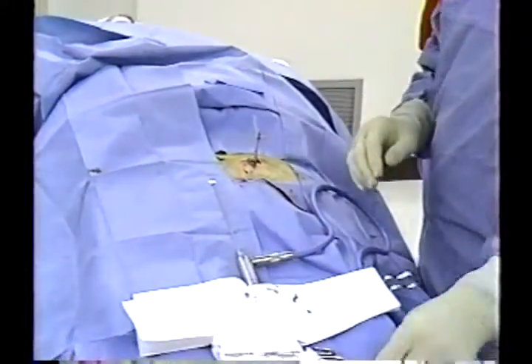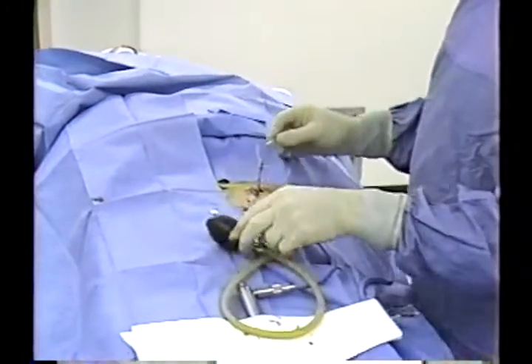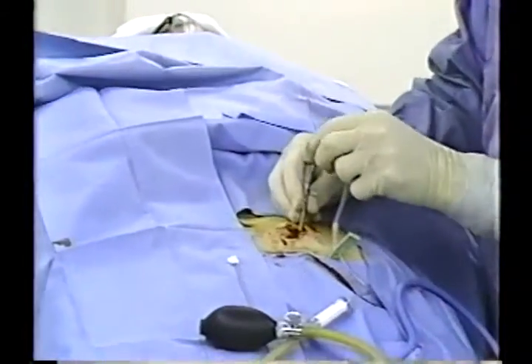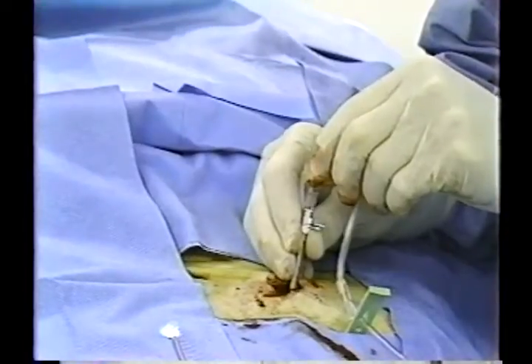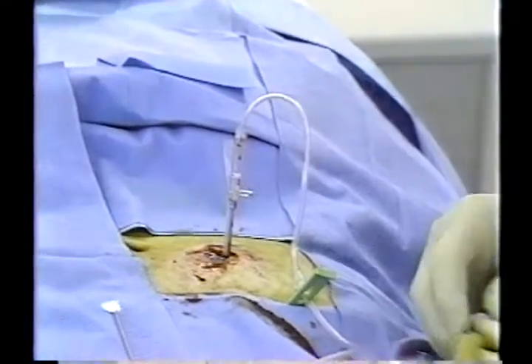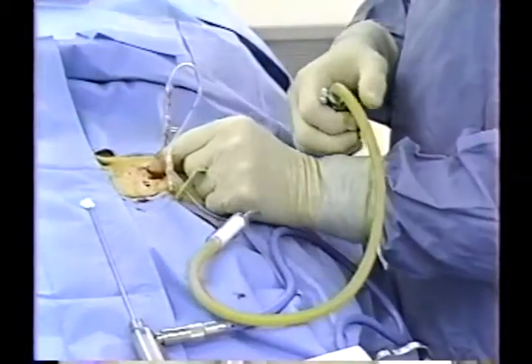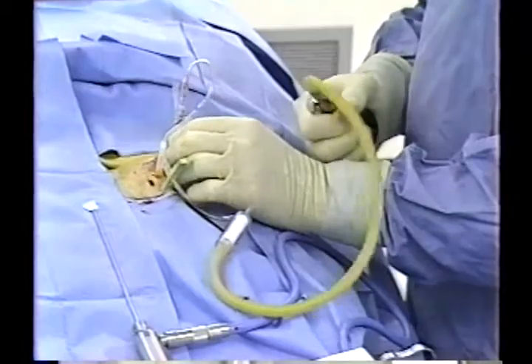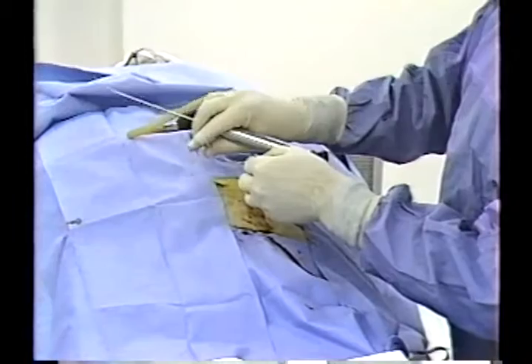The needle scope is then removed and air is placed into the abdomen utilizing the rubber bulb. It is suggested that approximately 1 liter of air be slowly infused for proper pneumoperitoneum for an adult patient. Each compression of the rubber bulb yields 20 cc of air. The sphygmo bulb and tubing must be steam sterilized only.